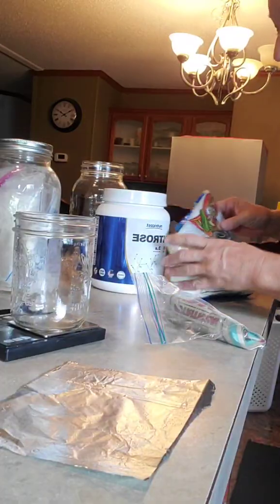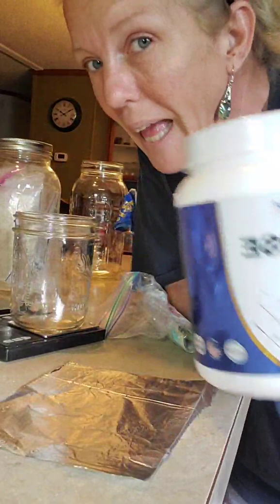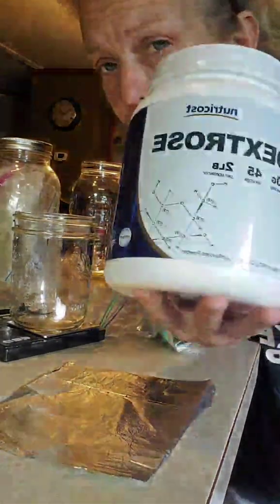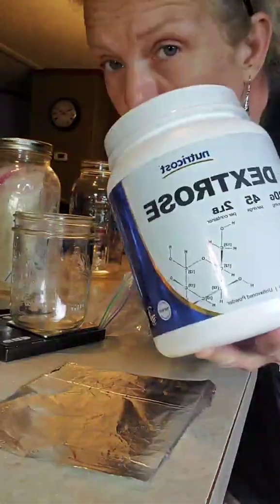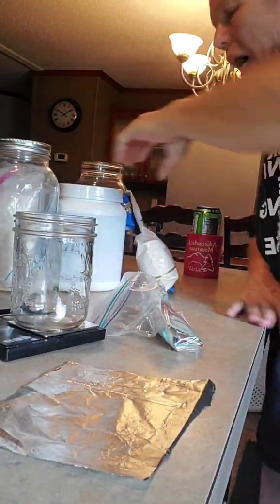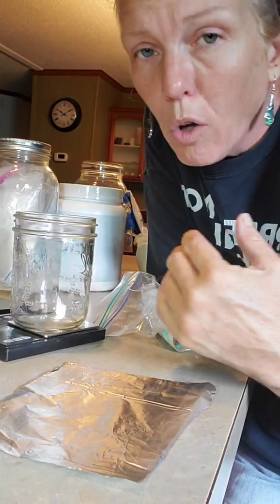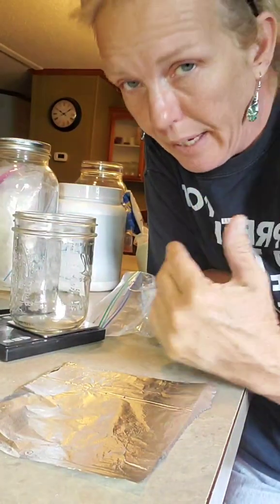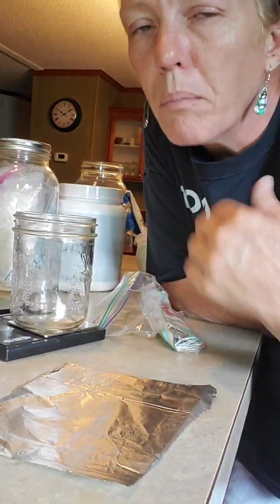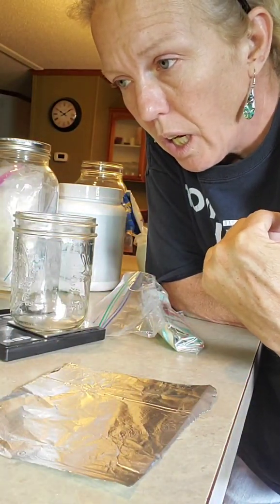You can buy dextrose powder, which, based on how much you need, it's like a gram. This will last you your lifetime. I think it was like $16. I use potato dextrose and what they call malt yeast extract agar. So MEA, malt extract agar.